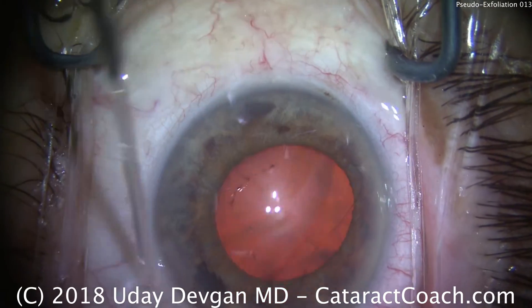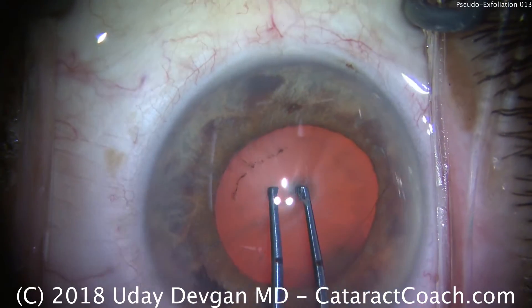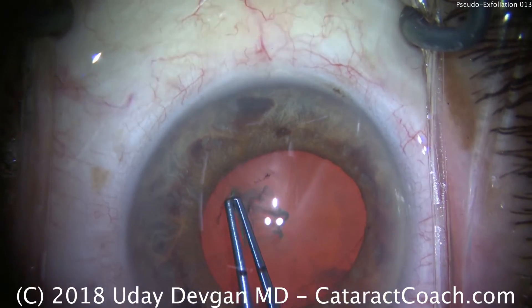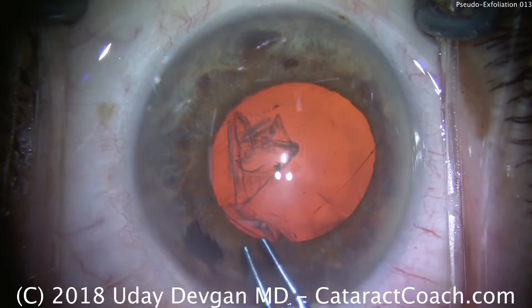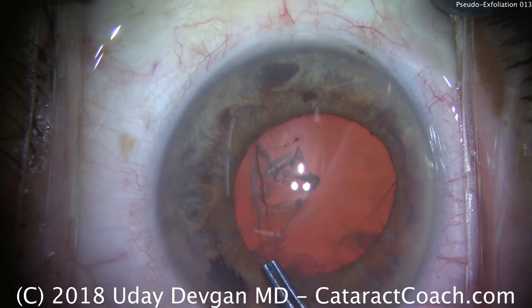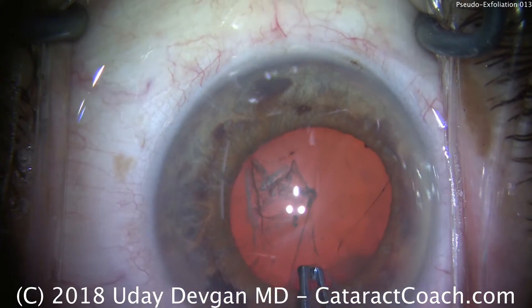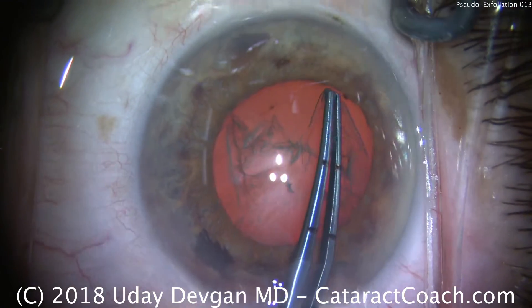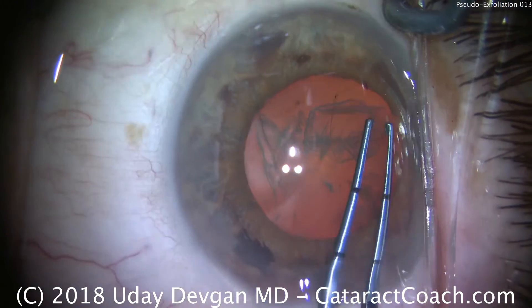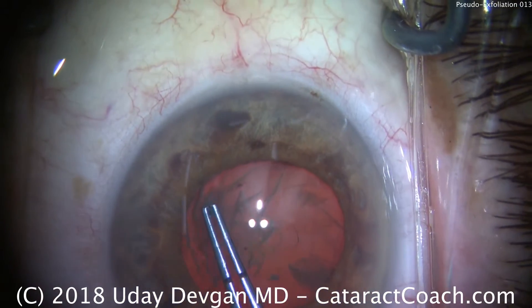This pupil may not stay this large; it may come down in the middle or end of the case. So we're going to make a sufficiently large capsulorhexis. Remember that patients with pseudoexfoliation can have post-operative capsulophimosis of the anterior lens capsule. So you do not want a small or baby-sized capsulorhexis — make a generous one, at least five millimeters, maybe even five and a half or six millimeters.